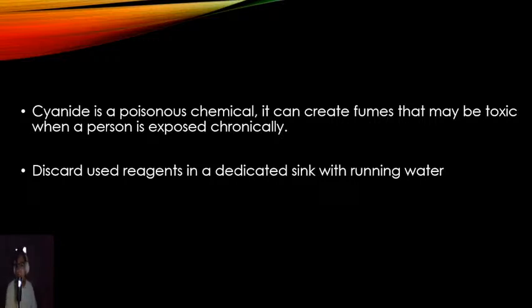Like for example, every start of the duty, Adrian and Joanna would often go to the lab and they would make the reagent. They would make it for 30 minutes on a daily basis for 2 years. Every time they would make it for 30 minutes, they would often leave the cap of the reagent box open. Usually, these things come in a box.